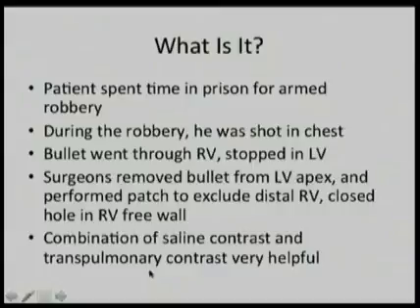Now I'm going to close there and just remind you that contrast is very useful. You should be using it in your echo studies, and I hope this has been helpful in helping you to set the images right, to decide to use a bolus versus an infusion, and to do those in the proper way, because they make all the difference in the world in getting good images. Thank you.